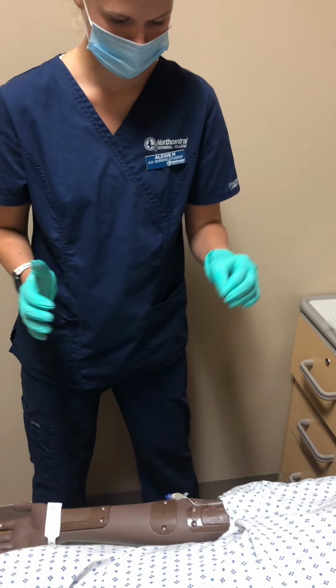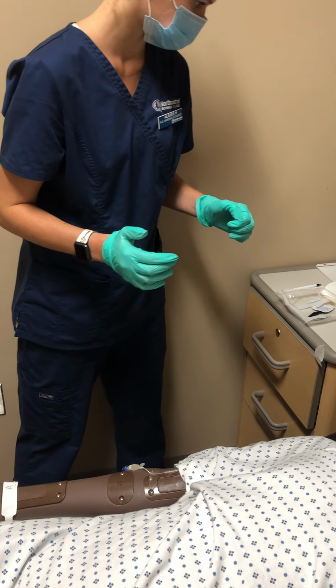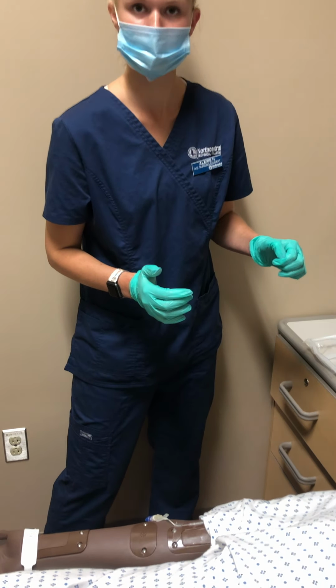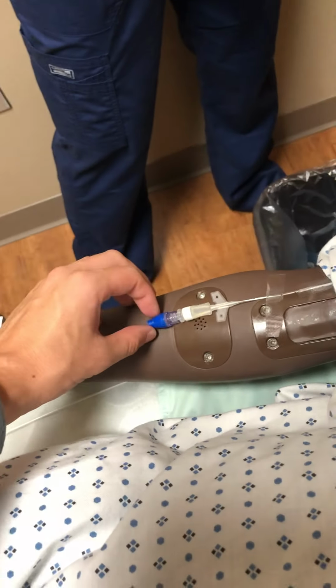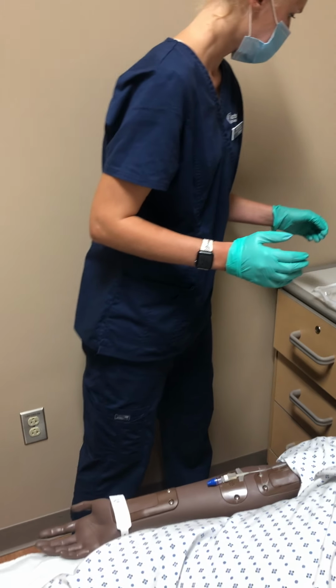Allow that to dry, and we don't want that to fall down. So I would have a second nurse put that back on. Could you put that back on, please? Thank you. And we'll verbalize, pretend that did not happen.